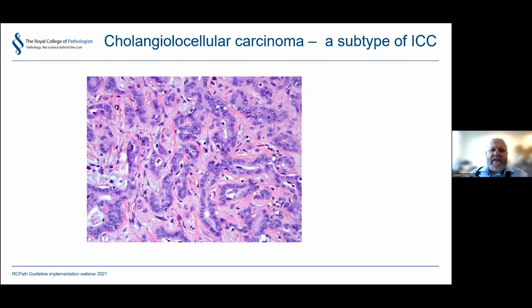And another type is the cholangiolocellular carcinoma. This was at one stage included in the combined tumor category, but it's now been taken up, very obviously on molecular grounds, as a kind of cholangiocarcinoma. And this just looks like anastomosing cords of bile ducts, often very well differentiated. I had one on my desk this morning. They can be CD56 positive. It doesn't make them neuroendocrine tumors. That's something you can see in proliferating bile ducts. So again, something to be aware of and to make sure you put it in the right category.